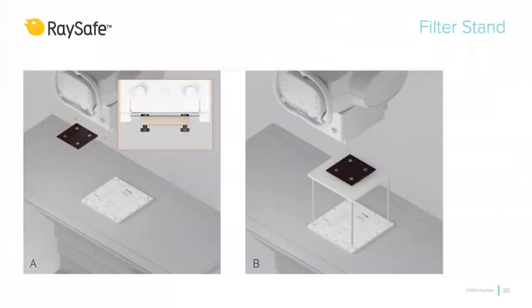Some tests need to be performed with an object that simulates a patient's body position between the tube and the detector. Certain X-ray devices feature a slot for filters located directly beneath the tube. For devices without this slot, we can use a filter stand. These pictures show ways of mounting the patient equivalent filter. And the filters here, it is aluminum, right? It is. When it comes to the patient equivalent, that is a 25 mm aluminum filter.